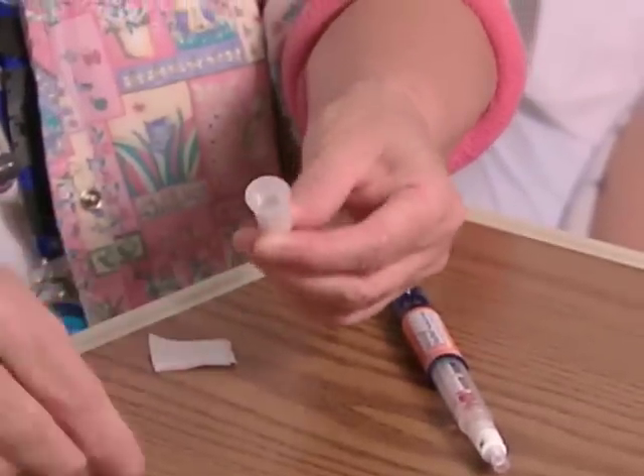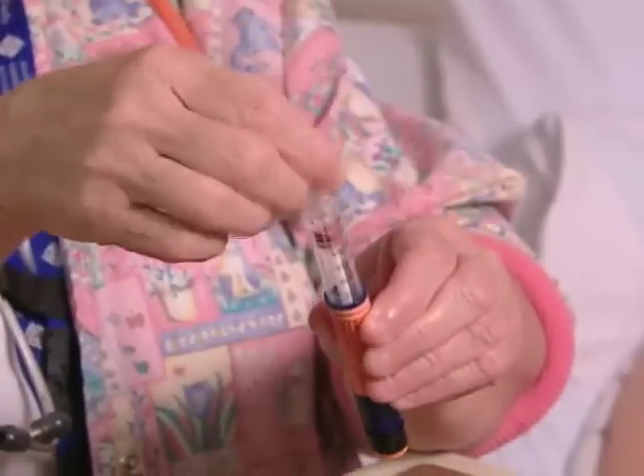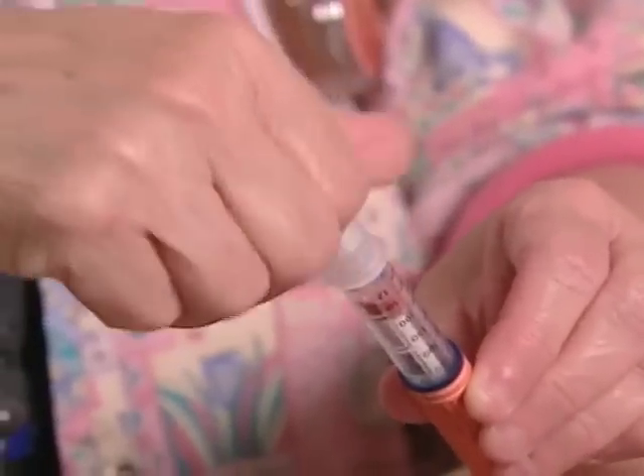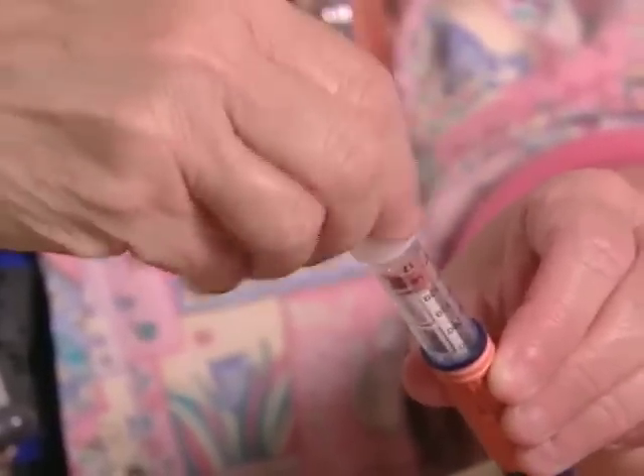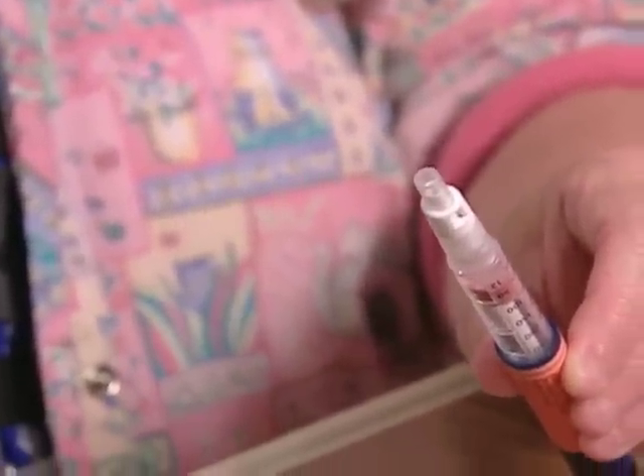Another problem is using the same pen for multiple patients, which is potentially hazardous. Attaching a new sterile needle to the pen before using it on another patient cannot solve the problem. That's because the insulin inside the pen's cartridge can become contaminated with biological material after the first injection while the original needle is still on the pen.